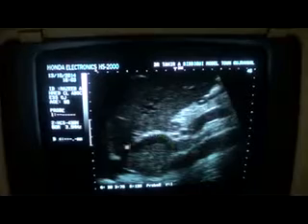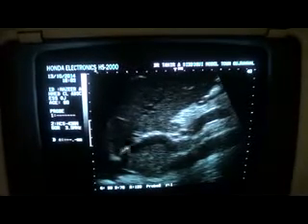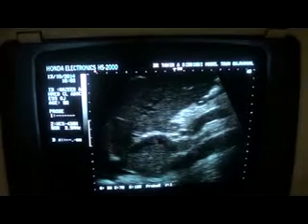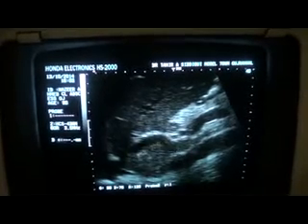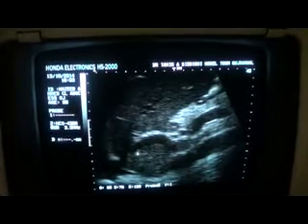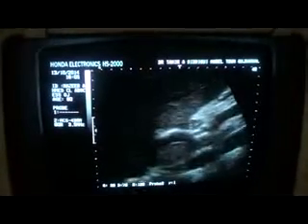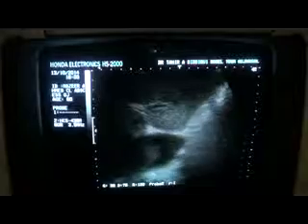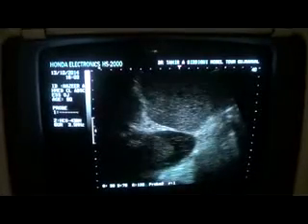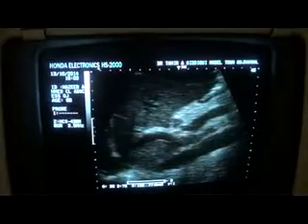This is the ligamentum venosum that is seen anterior, bounding the anterior boundary of the caudate lobe. This is the fluid part. This is the echogenic area within the cystic mass of the caudate lobe that is of infective nature unless proven otherwise. This is the transverse section of the same, and this is the longitudinal section. Thank you very much.